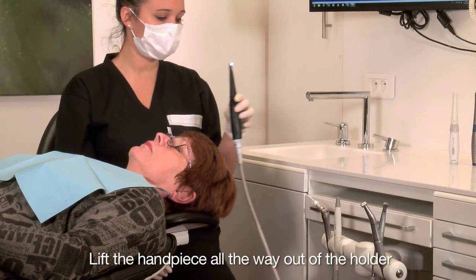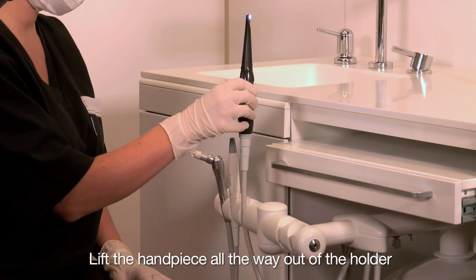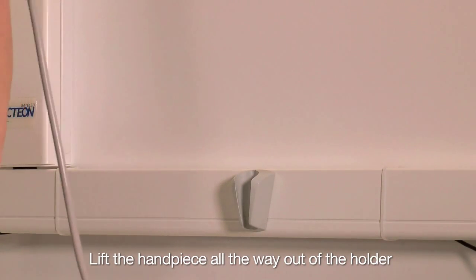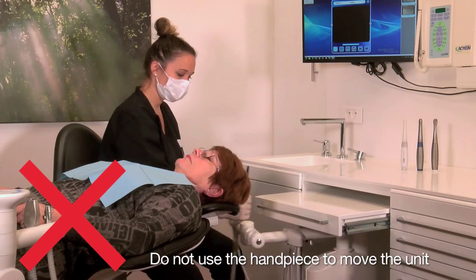Take the camera handpiece out of the unit holder. Be sure to lift the camera handpiece all the way out of the holder before moving toward the patient, or take the camera handpiece out of the SOPRO universal holder. Do not use the camera handpiece as a handle to move the unit.